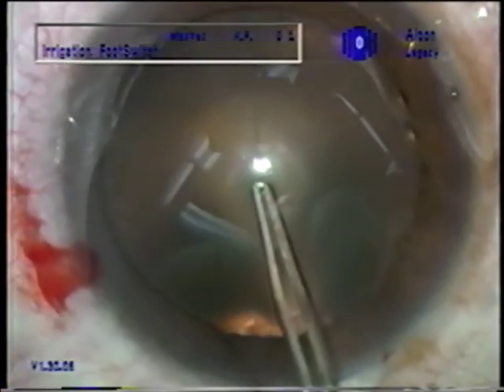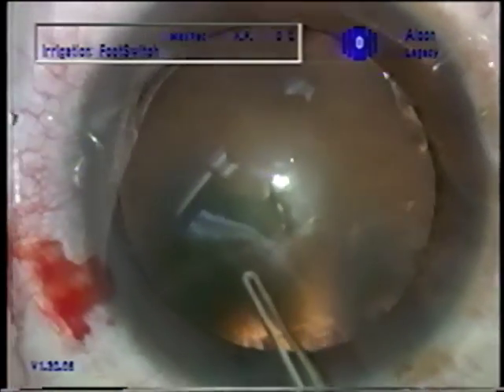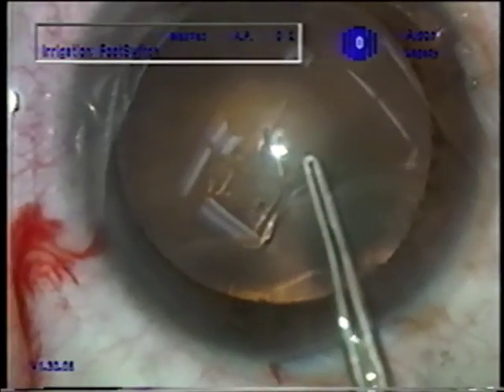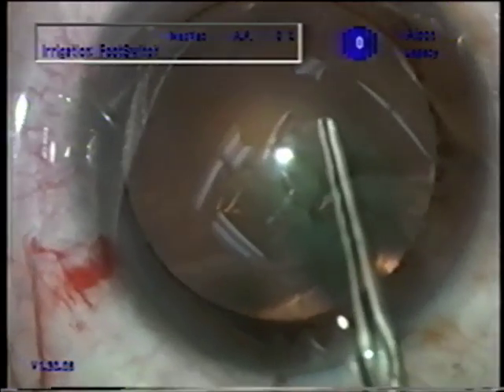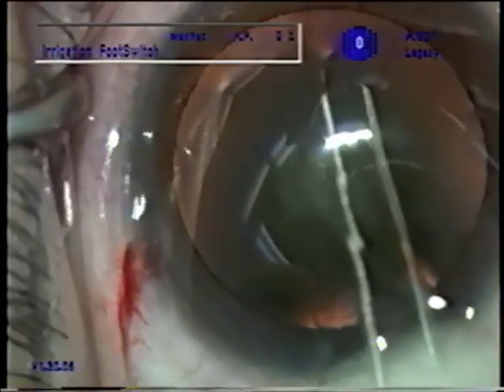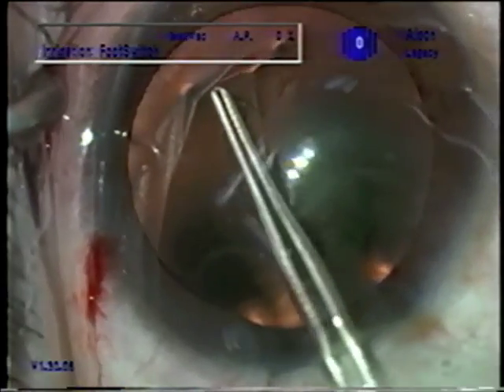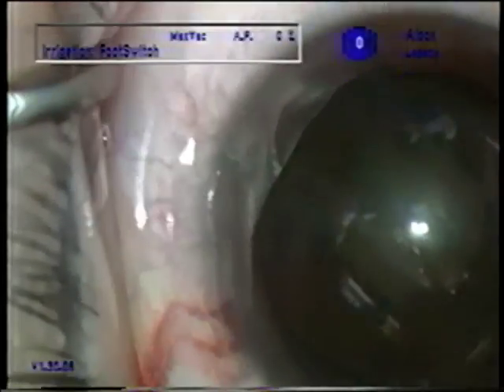I find that if the patient can look just to the side of the light and get the reflex of the optic nerve for a brighter red reflex, they're not having all the light exposure to the macula. Try to look at the light, please, or just a wee bit to the left of it.